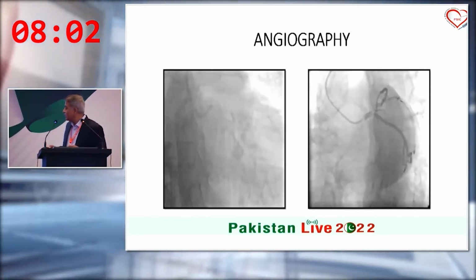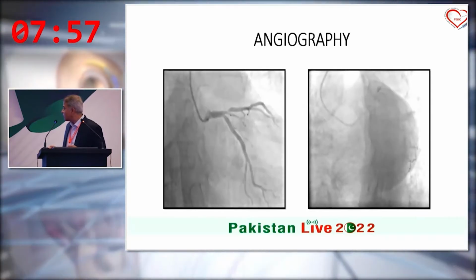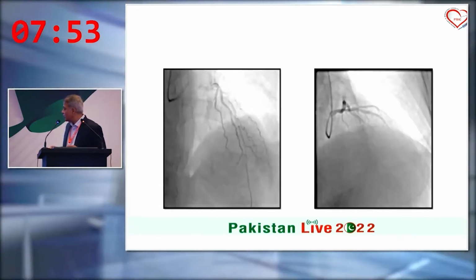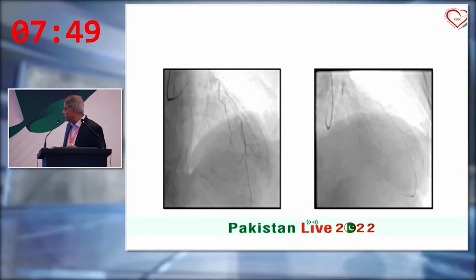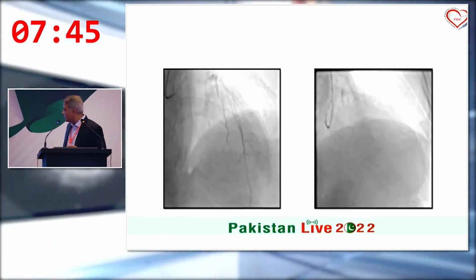And the LAD has a subtotal stenosis, more than 90%, and the distal LAD shows TIMI 2 antegrade flow. The mid part of the LAD is also diseased. Moderate disease is there, which was also later confirmed on the IVUS.